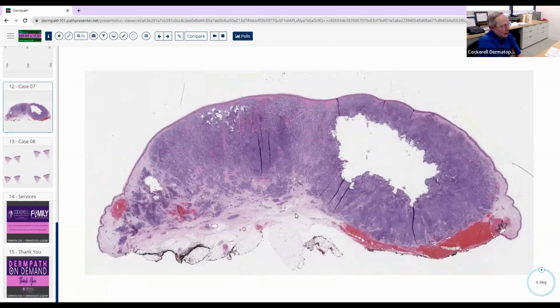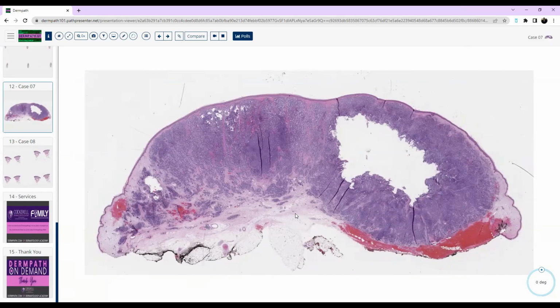All right, we'll shift gears to this fun lesion here. Okay, I'll take this one. So it looks like we have a shave, and I'm going with neoplastic. Good. And so I would say this is possibly malignant because it's very large and deep. Yeah. So possibly. Most likely, very likely malignant. 99% sure. It's got all the features of malignancy at low magnification.